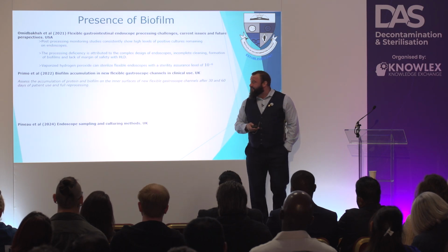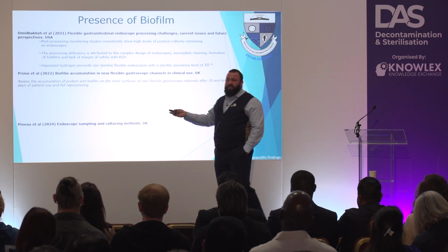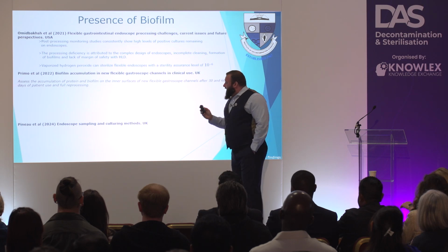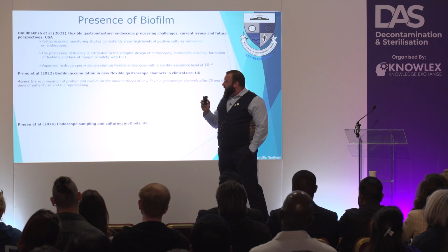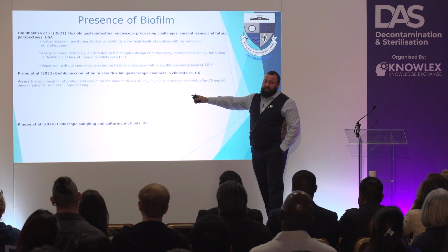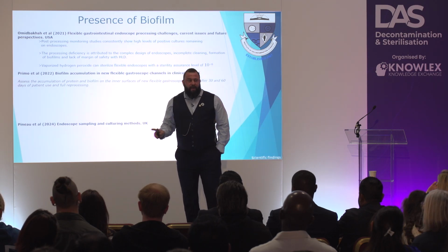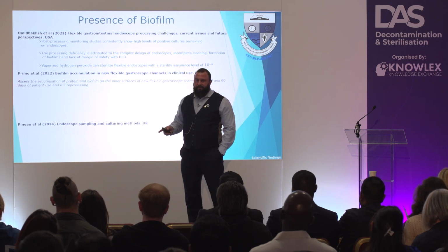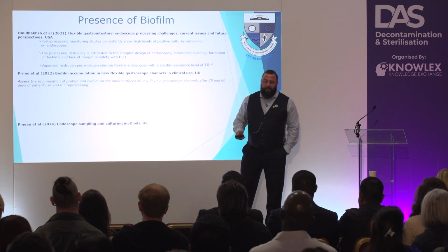Primo et al. This is my favorite one. And this one was in the UK. This is Cambridge, 2022. So we know it's all the current guidance that we're following at the moment. And this was the biofilm accumulation in endoscope channels, and it was the protein of biofilm surfaces of flexible endoscope channels after 30 and 60 days use. So this is the important thing to remember on this study before I show you the findings. Brand new endoscopes put into the system for 30 to 60 days before they were sampled, following full reprocessing, current UK guidance. This is what they found.